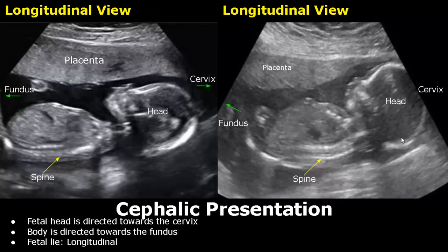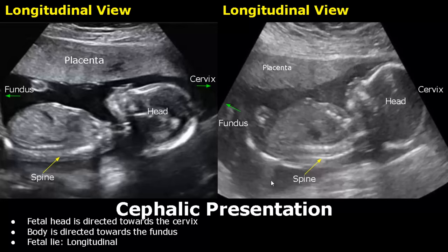Fetal lie is the relationship between the long axis of the fetus and the mother's spine. In these images, a longitudinal view is taken and the fetus is also appearing longitudinally inside the uterus — so this is a longitudinal lie. The fetal spine is oriented parallel to the mother's spine.